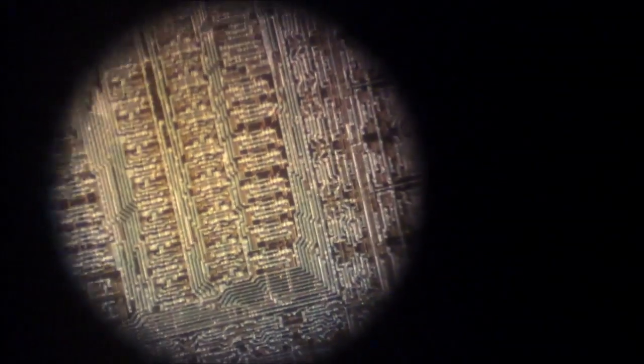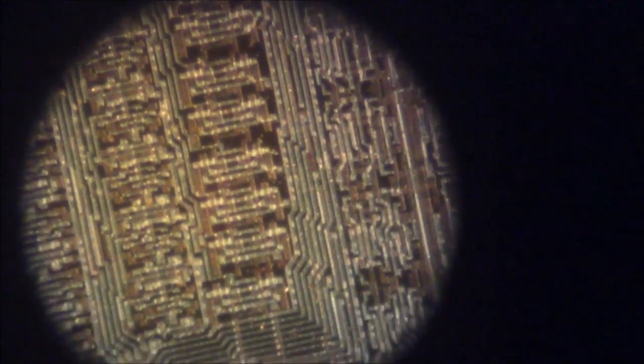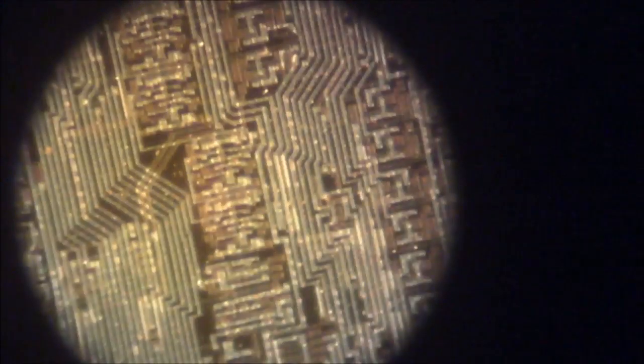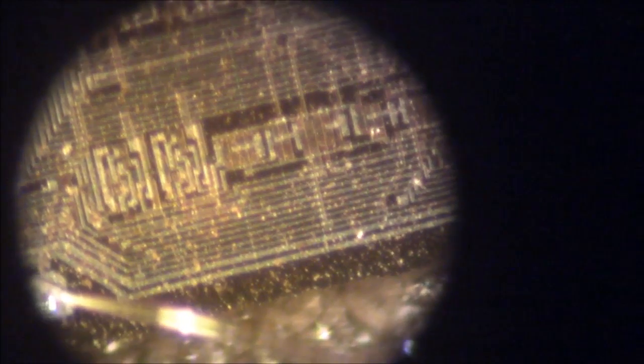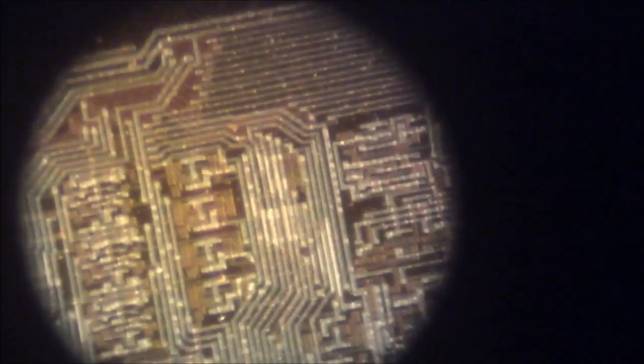I don't see anything too striking about the features on the chip. Let me zoom in here. I'm not going to pretend to know what any of these things are. Of course, there's a whole bunch of transistors and a whole bunch of wire traces all over the place, but I couldn't tell you anything more than that.